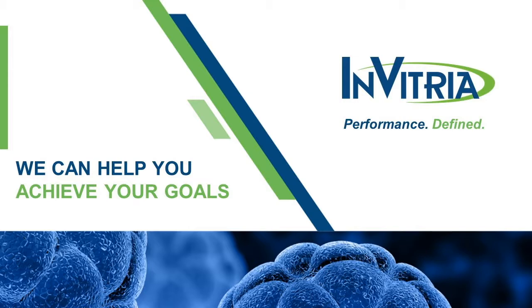So you can use more. In the case of CHO, another cell type that's very hungry for transferrin and insulin, we would actually recommend a 2 to 3X final inclusion. To answer your question about the final formulation, I believe at 1X insulin is going to be 10 mg per liter. I'm doing the math in my head, and I apologize if I mess this calculation up, but I believe it's 1 gram. The formulations are published on our website, and they're available for your reference.